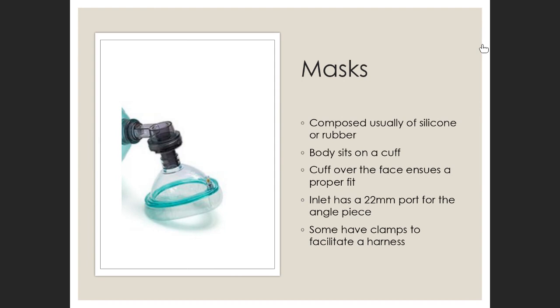Rodine, what are the indications for an LMA? Everything that does not need an endotracheal tube.